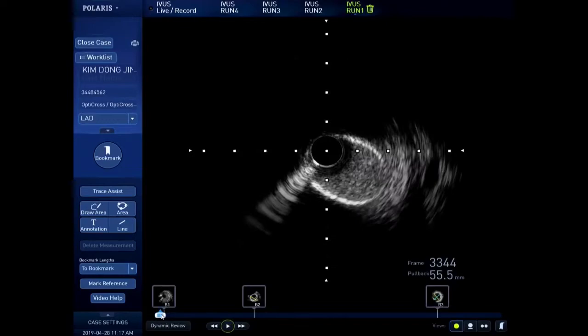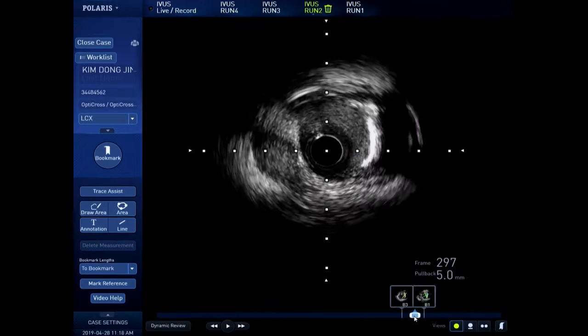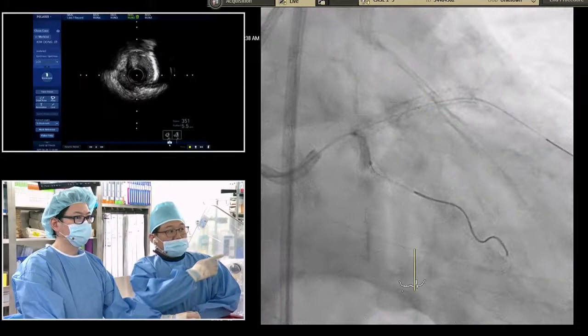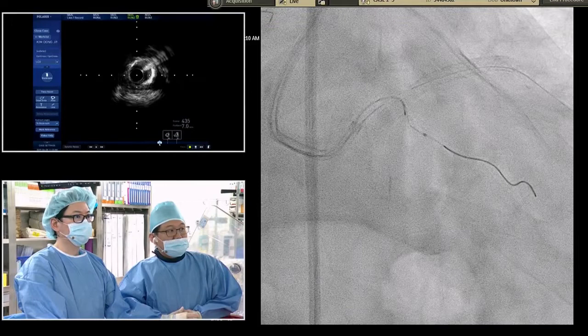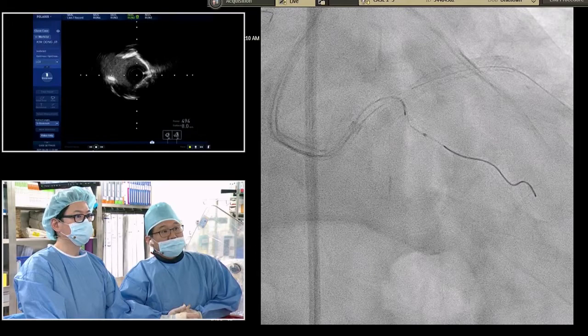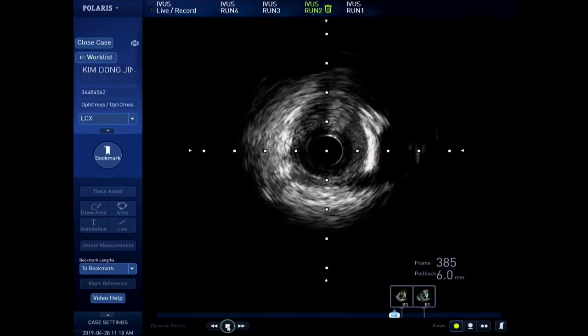Okay, and catheter. Could you show us the circumflex? Next, please. Next. So, previous. You can see the IVUS catheter cannot pass through to the distal circumflex, so we just see the proximal circumflex only. Proximal circumflex, please, and the vessel size. Full screen IVUS, please. Here is the proximal circumflex. We cannot pass through to the distal circumflex. Vessel size 3.0, heavy calcification. Here is the circumflex ostium.